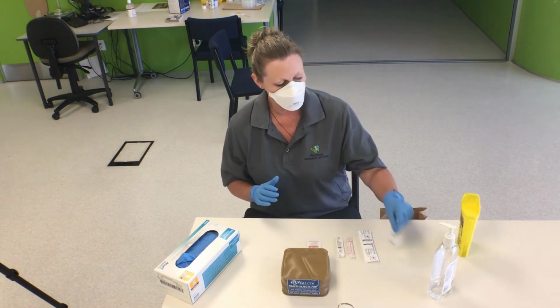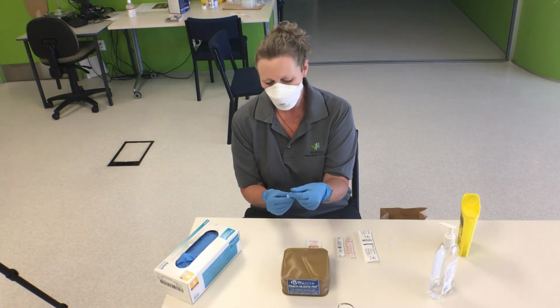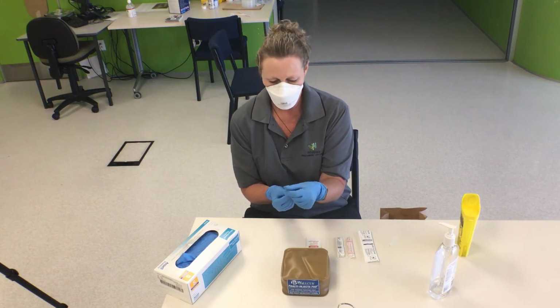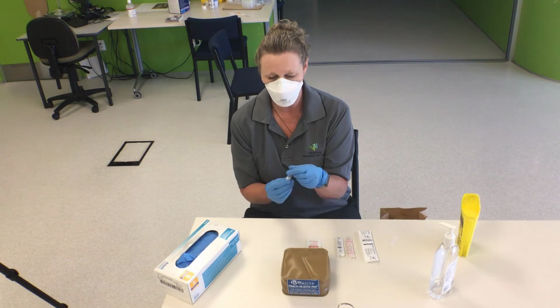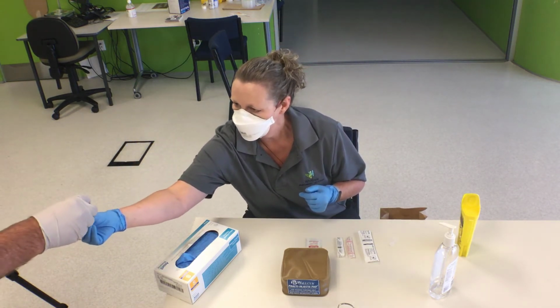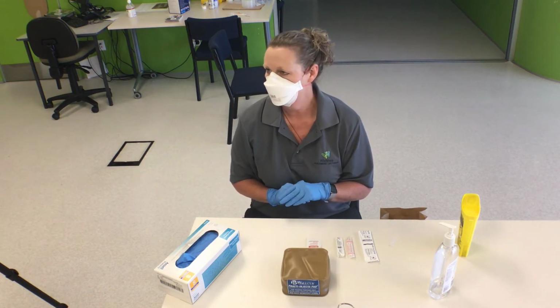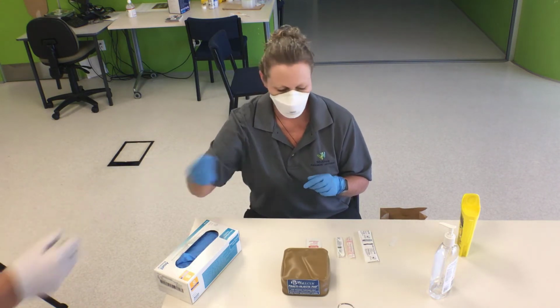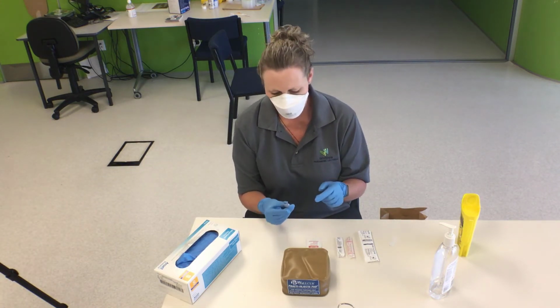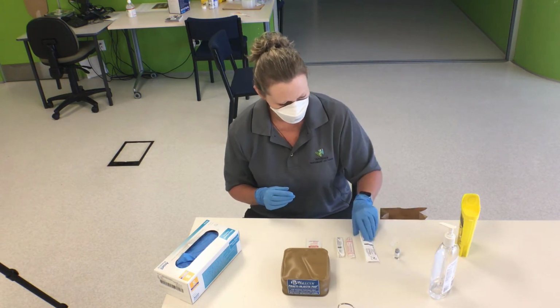So the next thing we're going to do is check our drug. So I have midazolam and its expiry 10/22, and I've got 15 milligrams in 3 mils. Could you please check that for me? I'm reading midazolam, 15 milligrams and 3 mils, expiring 10/22. Thank you very much. So I'm giving 5 milligrams, which means I need to draw up 1 mil of midazolam.